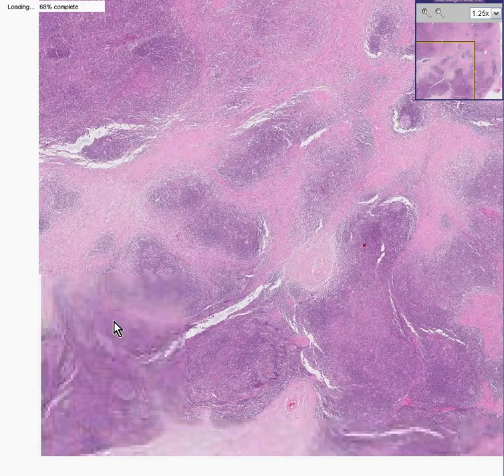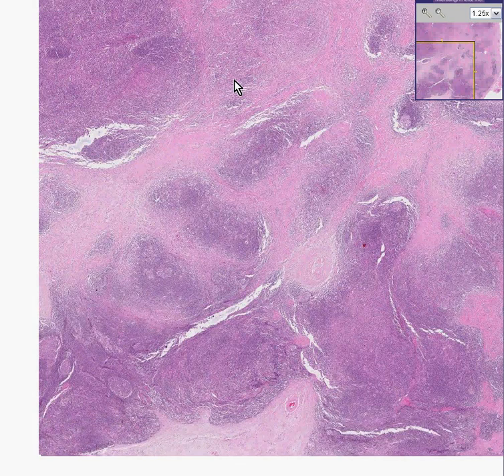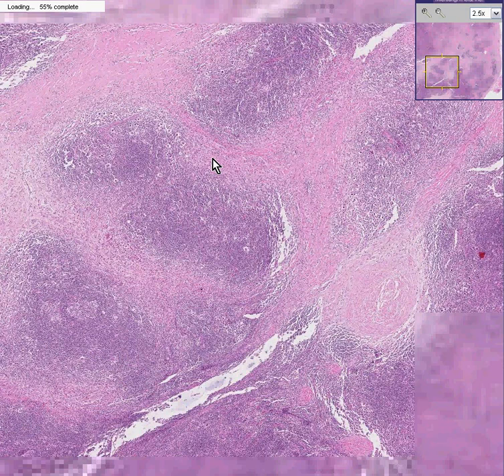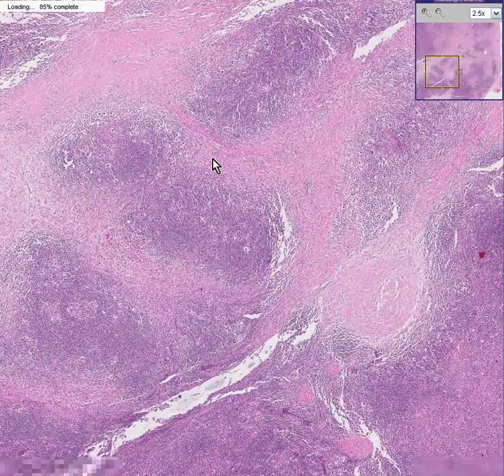It's a very simple microscopic fact how to differentiate Hodgkin's from non-Hodgkin's. You find Reed-Sternberg cells, because if a lymphoma has Reed-Sternberg cells, it's Hodgkin's disease. If a lymphoma doesn't have Reed-Sternberg cells, it's non-Hodgkin's lymphoma. That's a little bit oversimplified, and I'm sure people would be angry at me for saying that, but in all practicality, that's the basic algorithm we all use in our everyday practice.